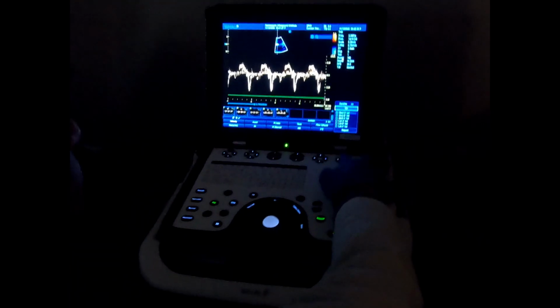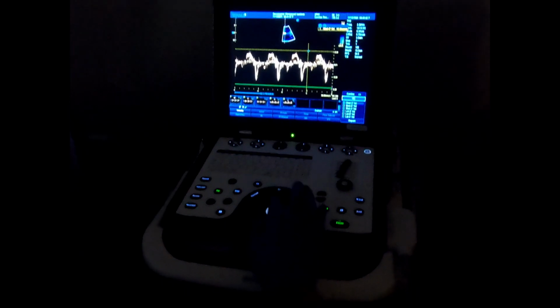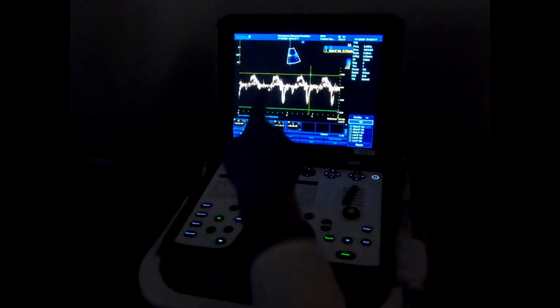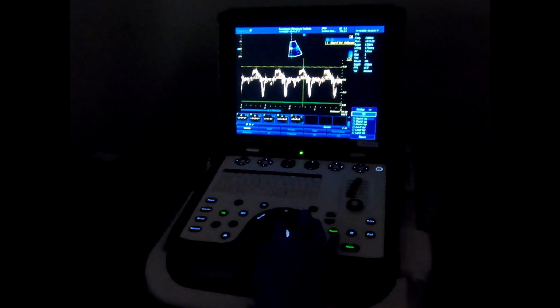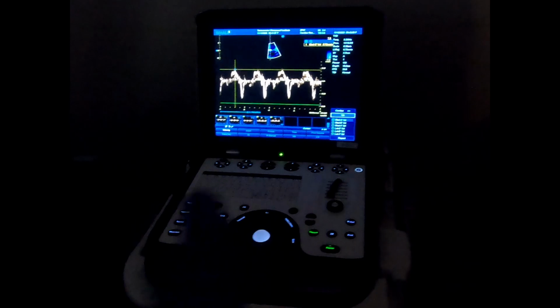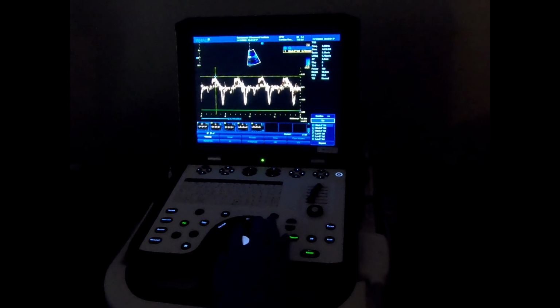So you go and select the S first. Put the caliper, which one is the tallest? The first one is tall and the third one is the tallest. So this is your S prime, and this is your S prime. Go with the second S prime. If you have only one like this, go with that. But if you have an S1 and S2, go with the S2.